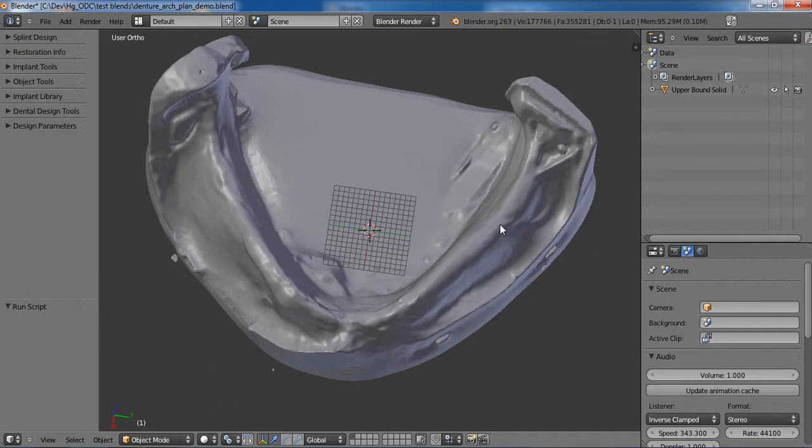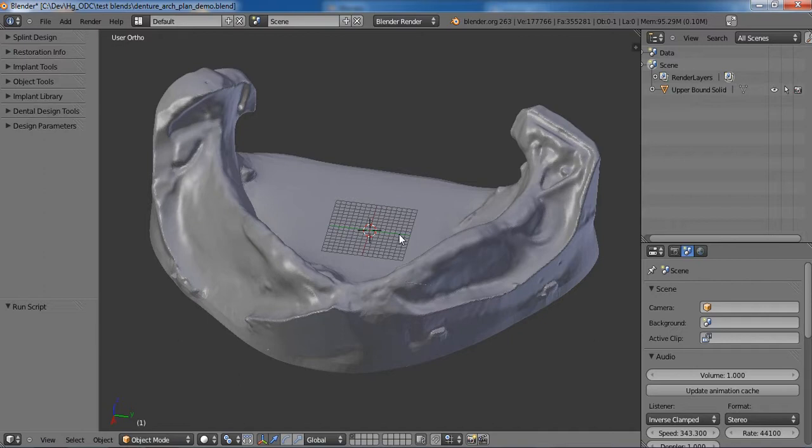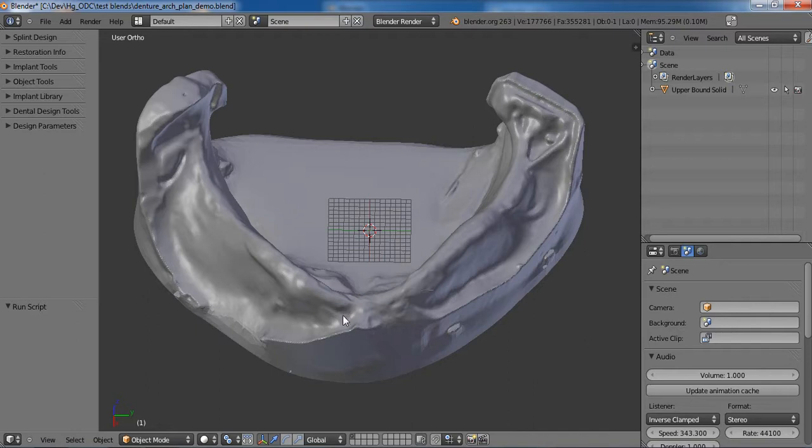He had all his teeth extracted, and he's about 50 years old. His guardians are interested in having upper and lower dentures made for him. Without getting too much into the case, his tongue is very large, so large that it was almost impossible to take a traditional full arch impression. We couldn't get the tray to get past his tongue and to seat on the ridges.